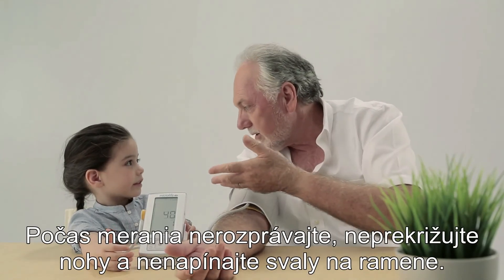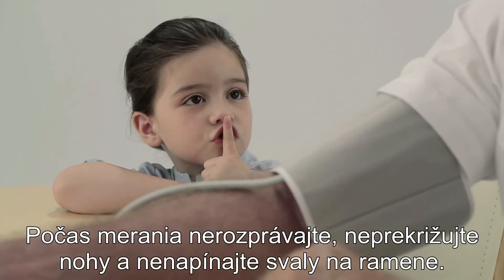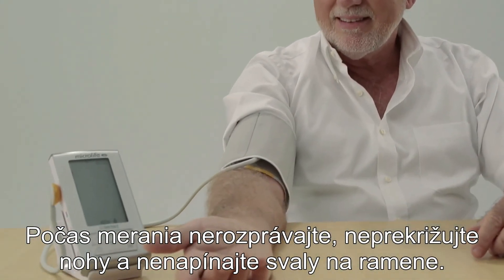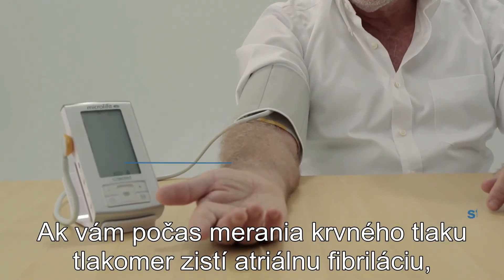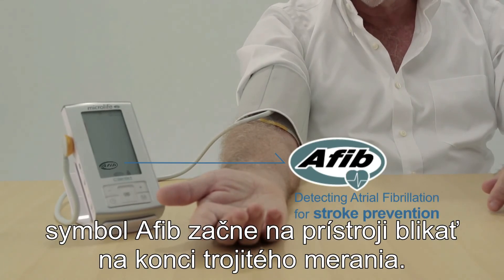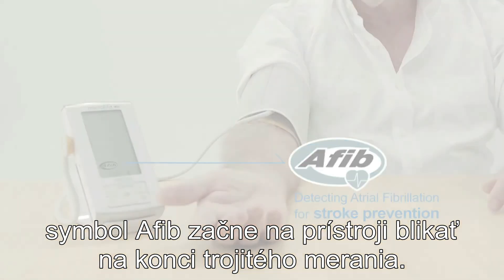During the measurement, do not talk, cross your legs, or tense your arm muscles. Breathe normally. If Afib is present during blood pressure measurement, the Afib icon is displayed flashing at the end of the triple measurement.